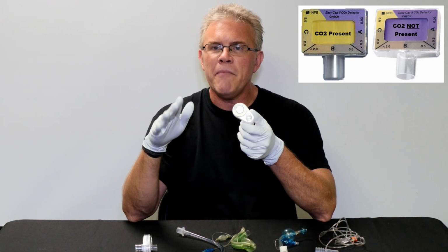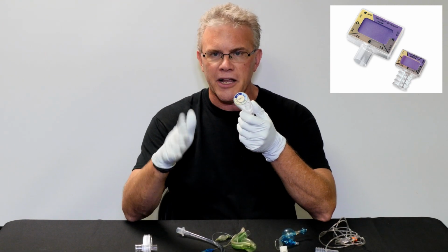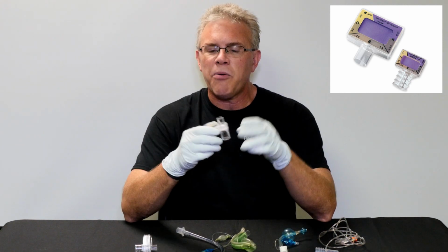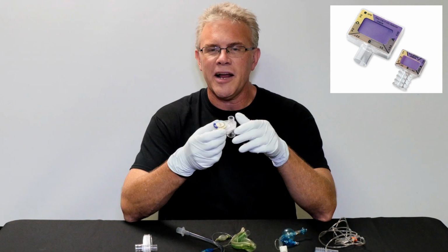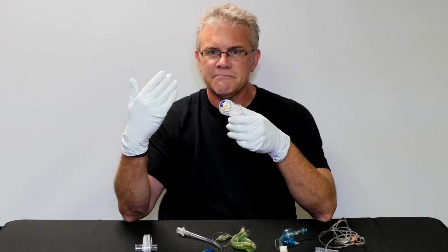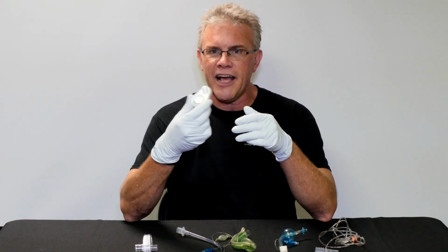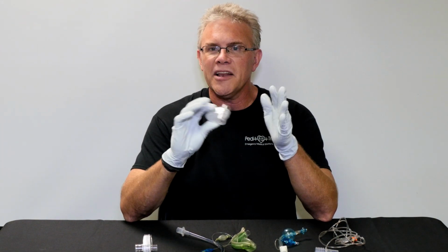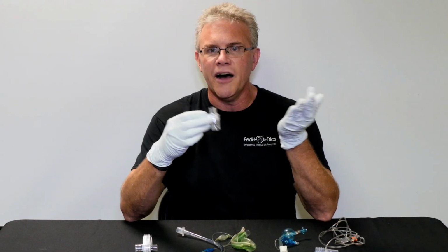And remember, they now make them in various sizes, meaning all the way from the smallest of babies to the biggest of big people. And as long as you're alive, they work great. The problem is, do these things work if you're dead? The answer is not so well, and the rationale is you're dead. If you're dead, you're not producing a whole lot of CO2 because you're dead. So that's a huge deal because in the presence of death, this may or may not change colors even if it's in the right spot. So if you're alive, they work wonderful. If you're not, you have to understand the limitations of your toys.